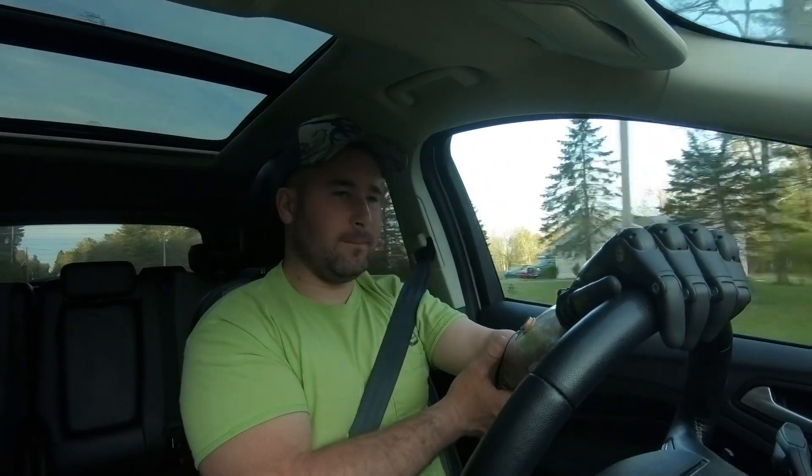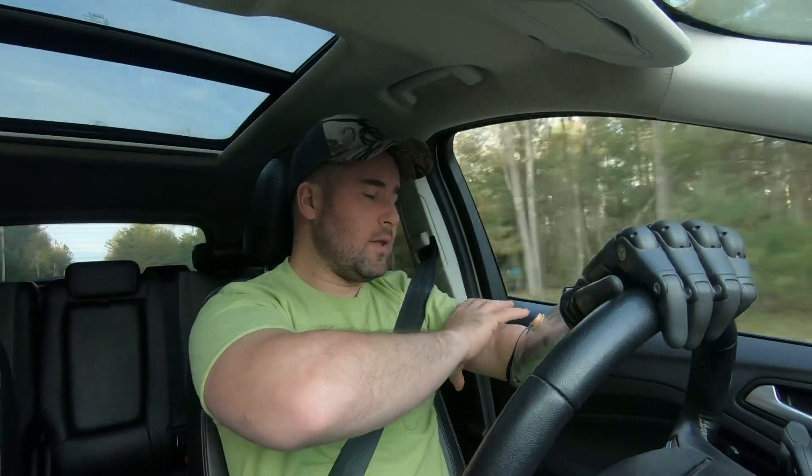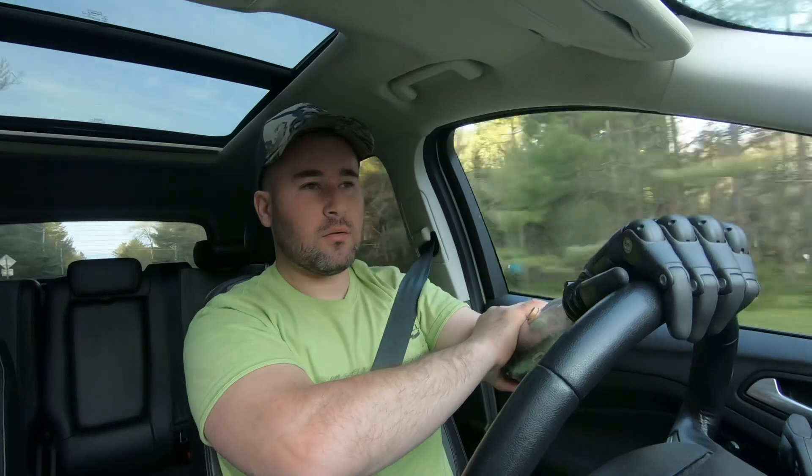Maybe some people don't experience that, but it's a possibility — because I'm actually dealing with it. I got this in September, so we're on our ninth month going on our tenth. It's hard to believe — time flies. But it's starting to shrink and not fitting as good, and I don't have that suction inside the arm lasting as long as I used to.